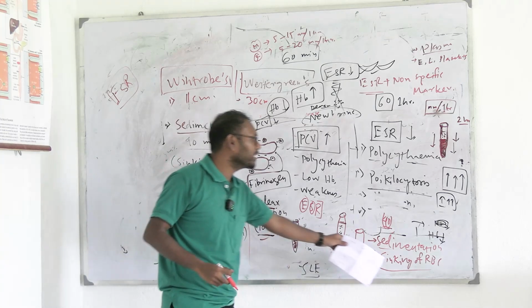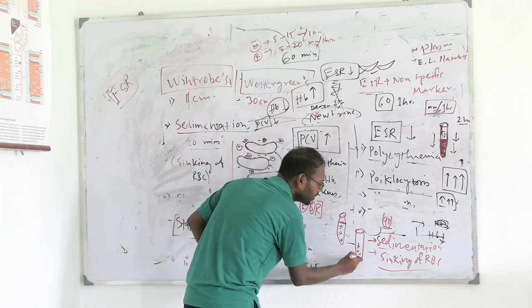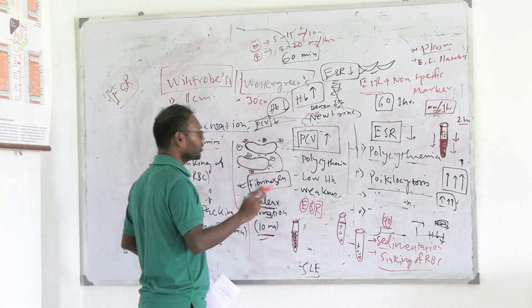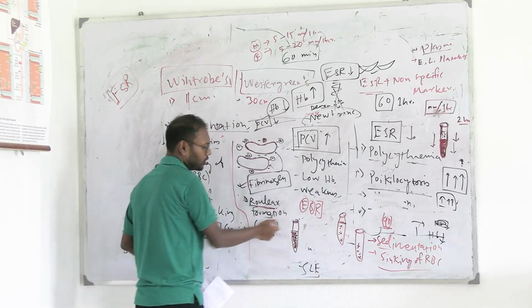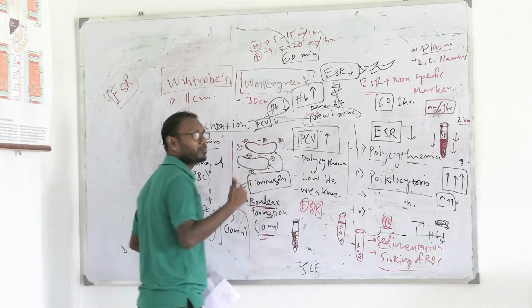Next, the sedimentation will occur for 40 minutes, right? So this is also called sinking of RBCs because they are getting below, they are sinking in the test tube, one by one. Okay, so this is called sinking of RBCs. So this is actually the second procedure which takes about 40 minutes. What is 40 and 10? 50. What is left? 10. So there is another procedure.